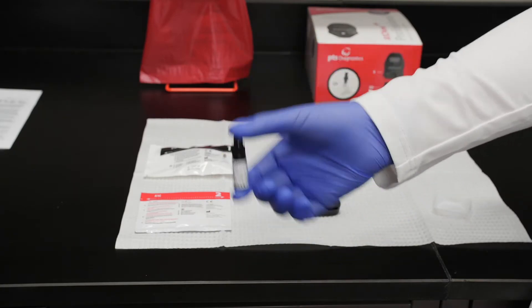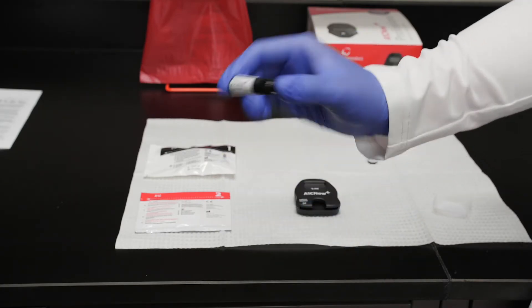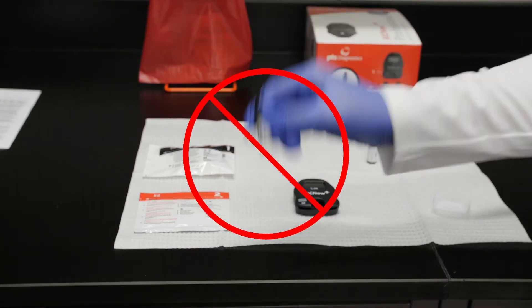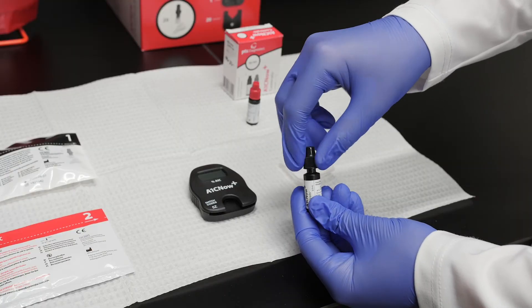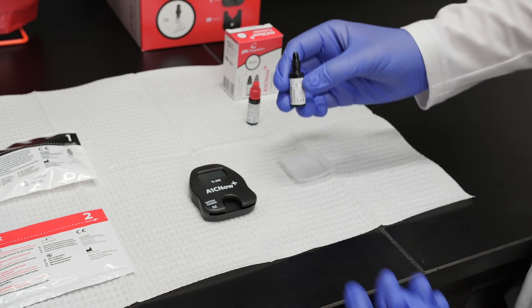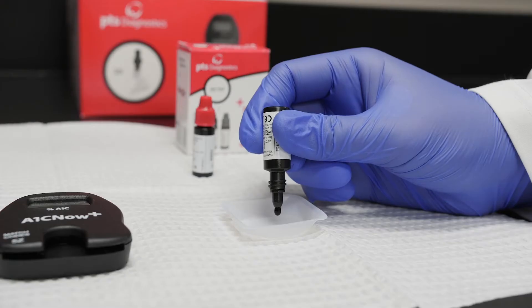To begin, pick up the vial of Level 1 control solution. Gently invert the vial at least 10 times to mix. Do not vigorously shake the vial. Remove the cap and turn the bottle upside down. Carefully squeeze the vial to deliver one drop of control solution onto the clean, flat surface.